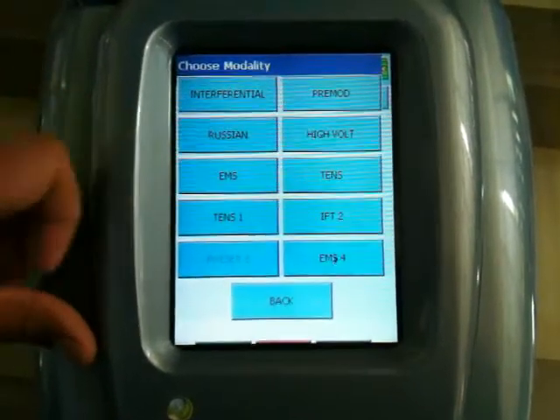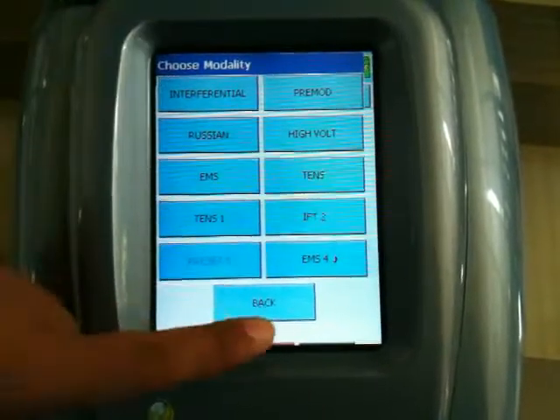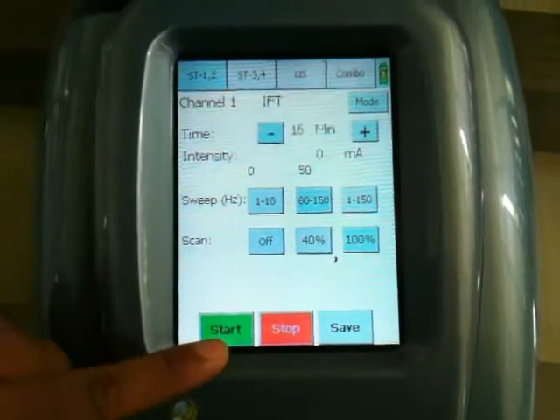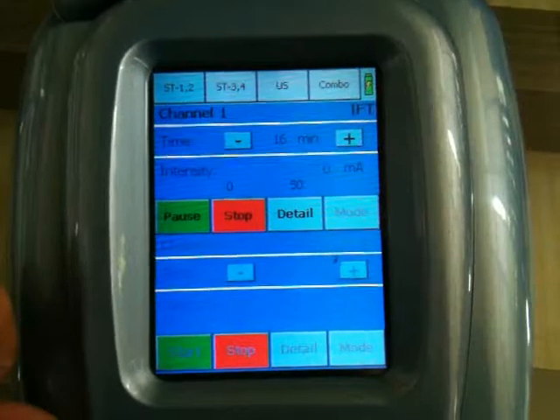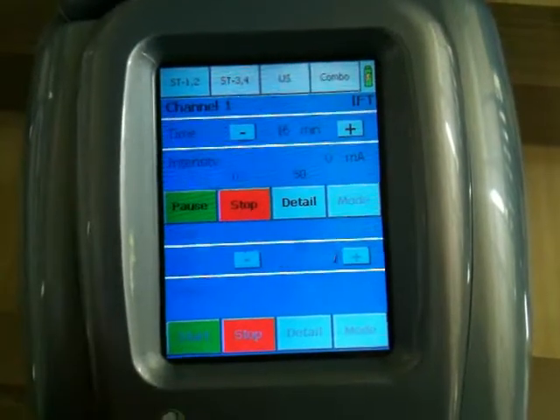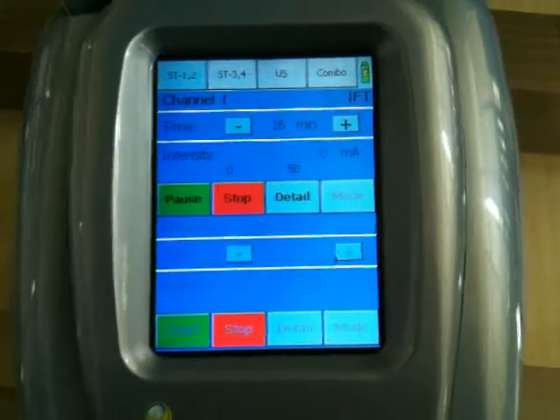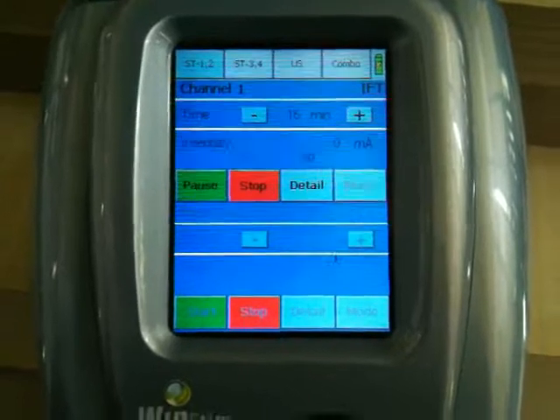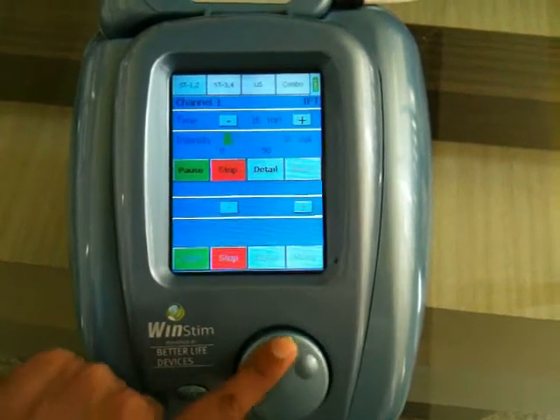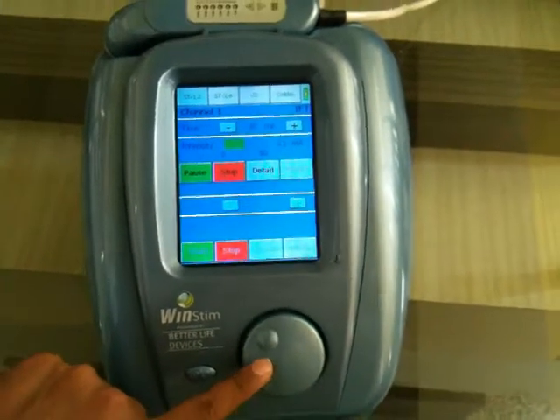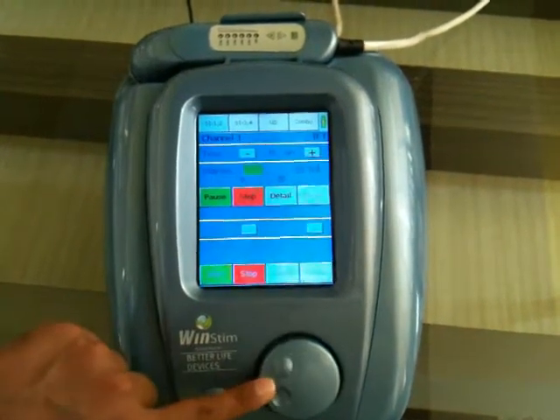Here you can select any of the modalities at any instance. Now we are just starting the treatment. After the treatment starts, the screen turns blue, indicating the treatment is active. You can increase the intensity by rotating the knob clockwise, or decrease it by rotating it anti-clockwise.